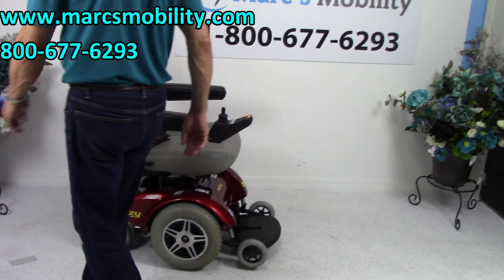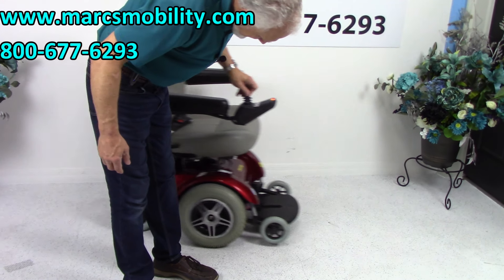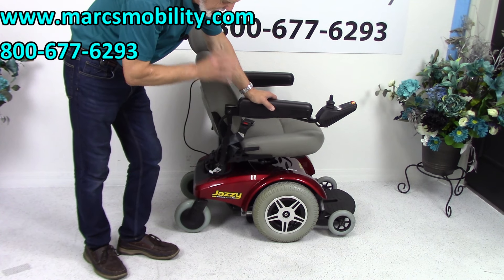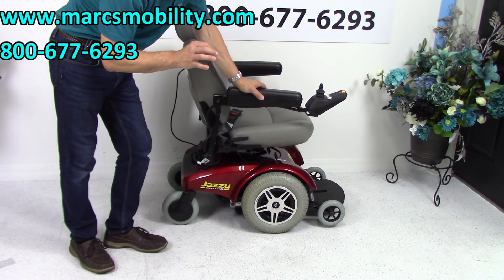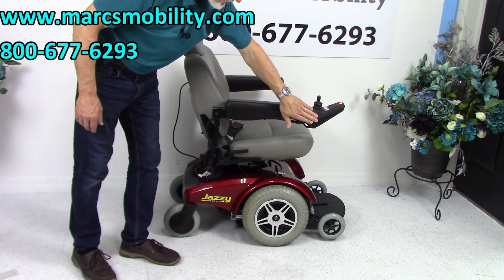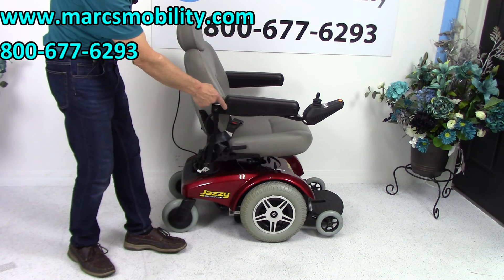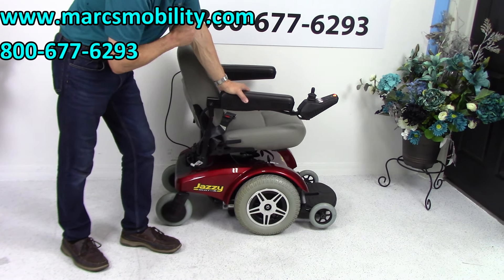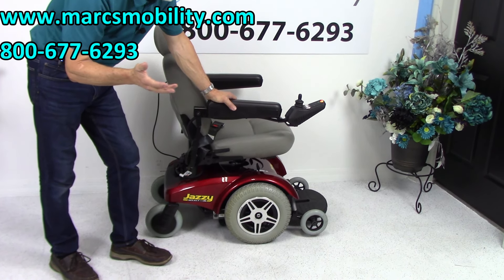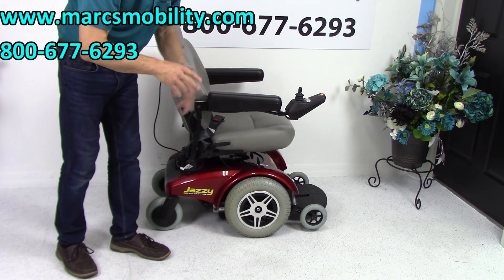Let's recap. This is the Jazzy Select 14XL. It's got the extra-large capability of 350-pound weight, 22-inch seat by 18 deep, flip-up arms, joystick on the right — can go to the left if you're left-handed — captain's seat with adjustable back, swivel seat, solid tires, built-in charger, and flip-up footplate. It does take two batteries, which will give you about 15 miles on a charge — though that depends on the weight of the user and terrain, so mileage will vary.